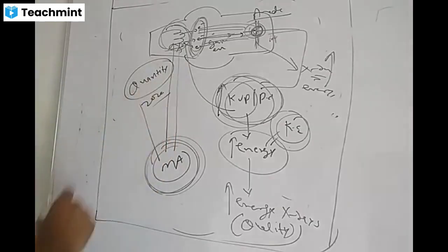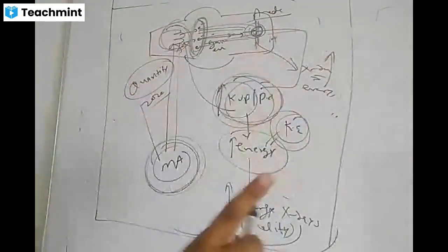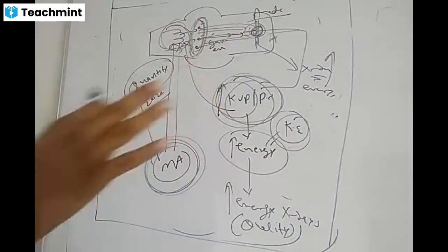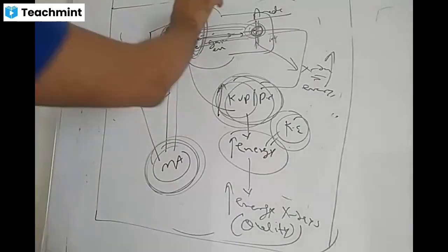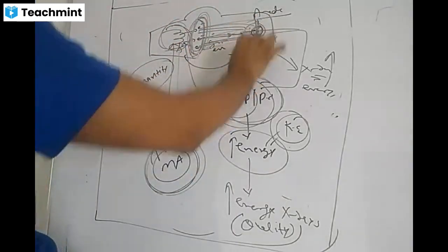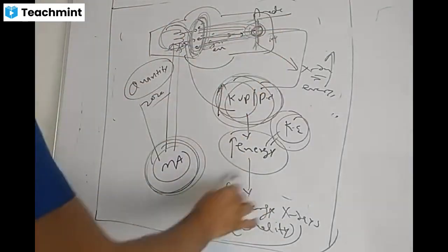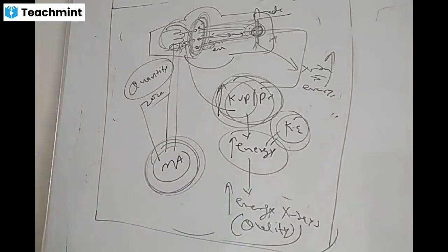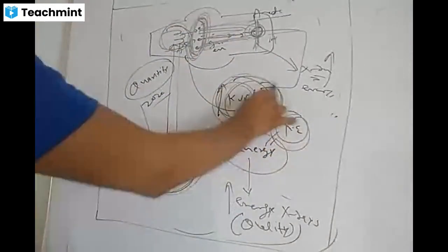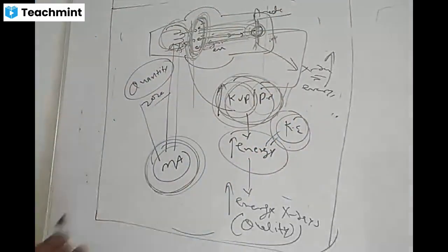That was the 2020 MCQ. The next thing is, these electrons are without any energy. They would be of no use without energy, because we want energy to move the electrons towards the anode. They strike with that energy and bring out X-rays of different energy. So to give them energy, we give kVp, a potential difference, a voltage difference between these 2 points.